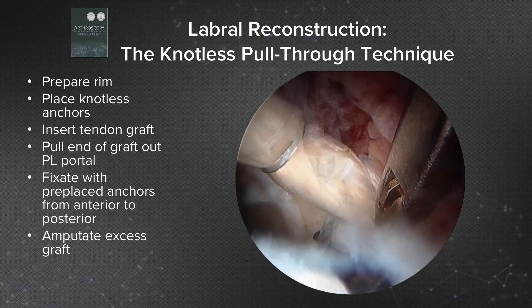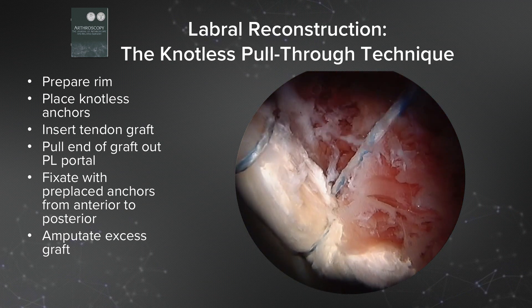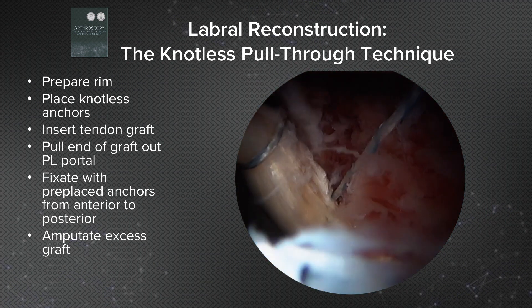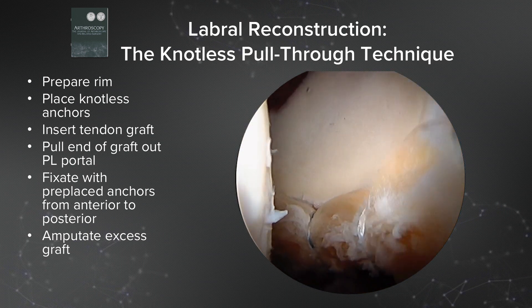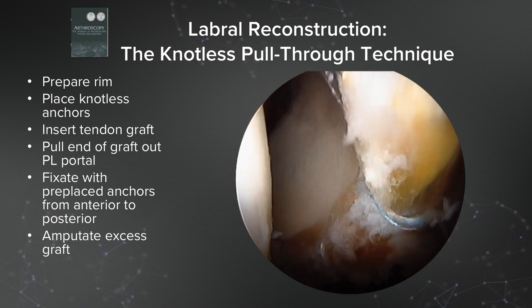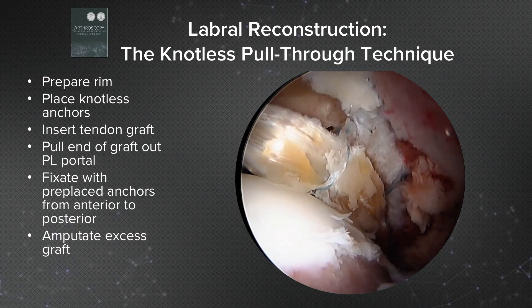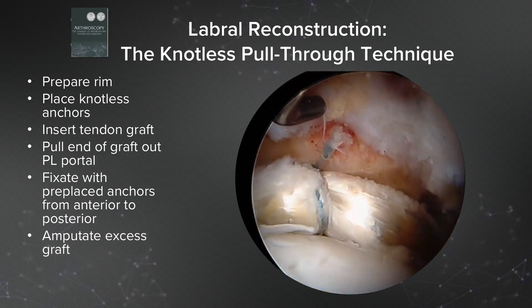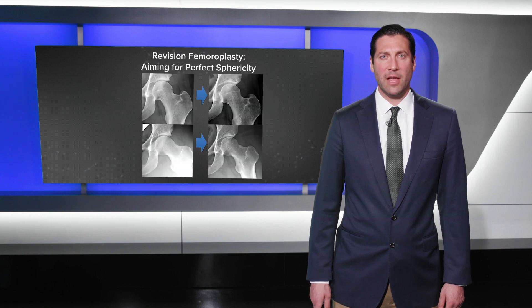Note that the graft has not been sized — we have about a 30 centimeter tibialis anterior allograft. Now that we've completed the graft, we can amputate the excess graft from the posterior end. For the circumferential labral reconstruction, we take traction off and we see that we've restored the seal of the labrum against the femoral head.